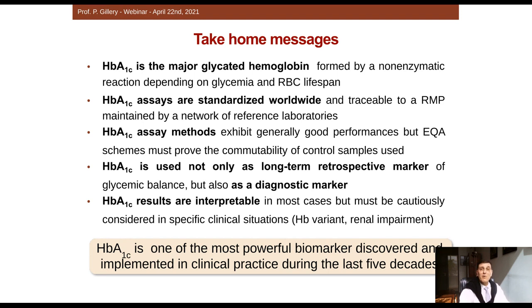They are traceable to a reference measurement procedure maintained by a network of reference laboratories. HbA1c assay methods exhibit generally good performances, but EQA schemes must prove the commutability of control samples used.